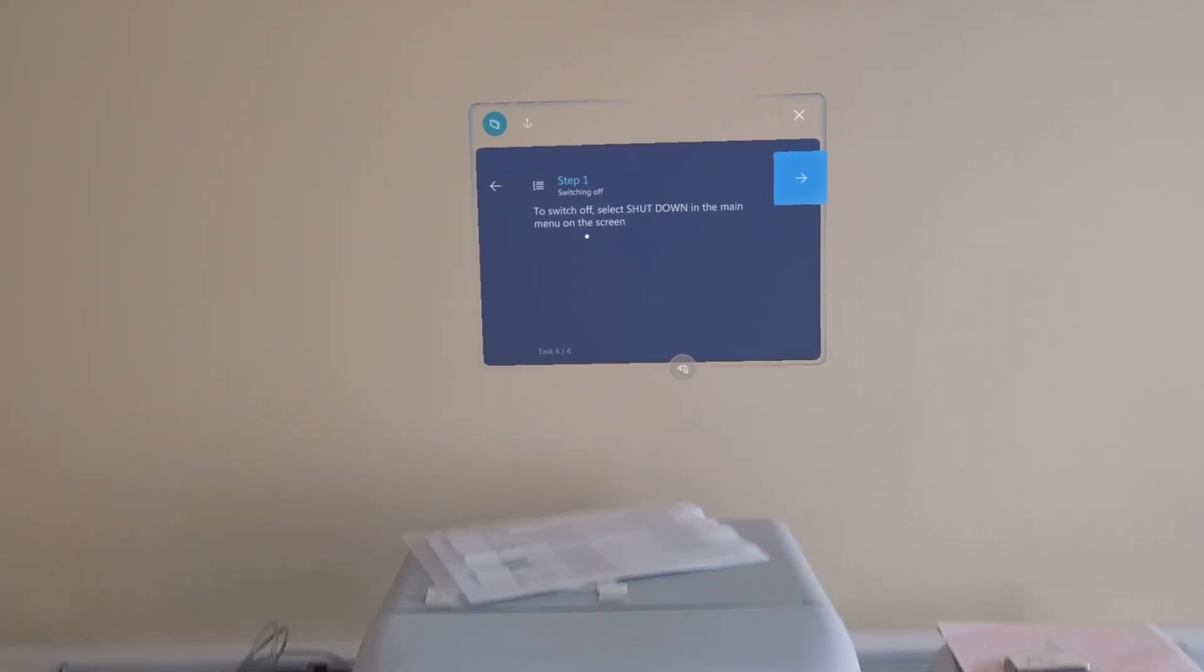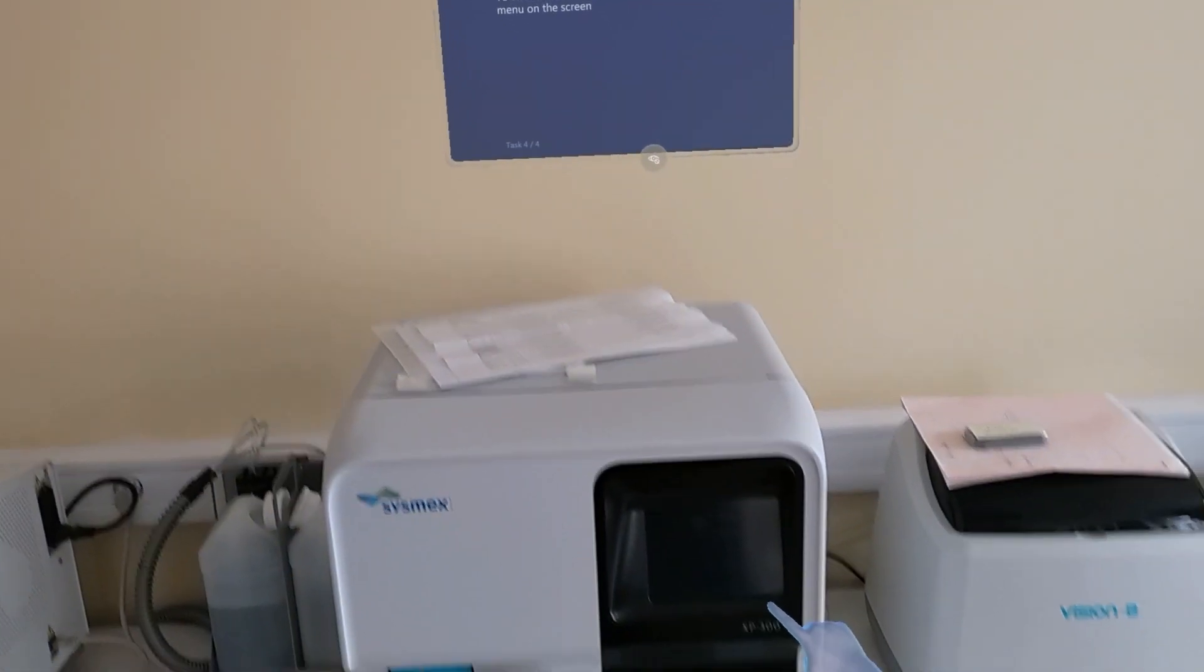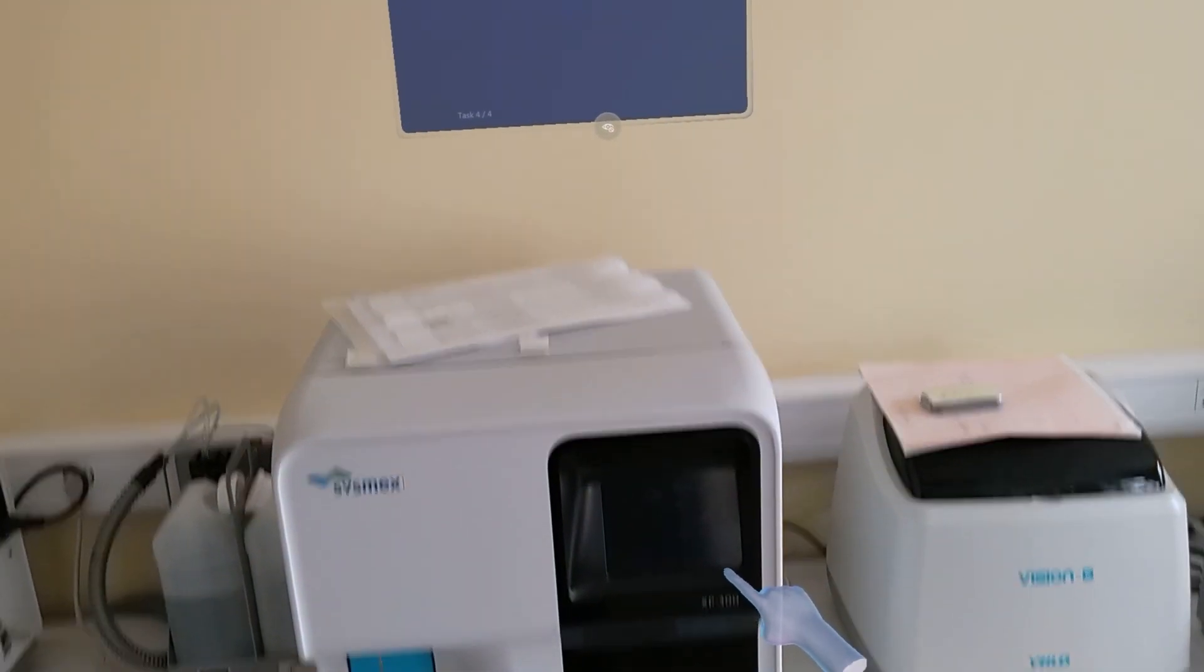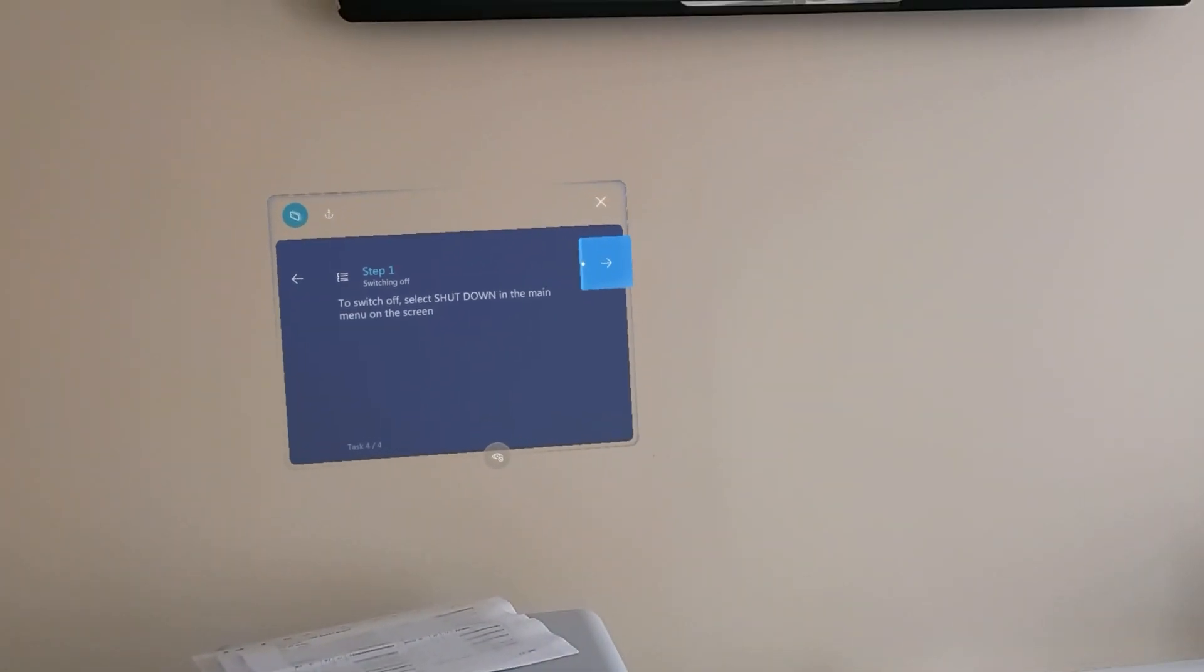To switch it off, we need to select shutdown in the main menu.